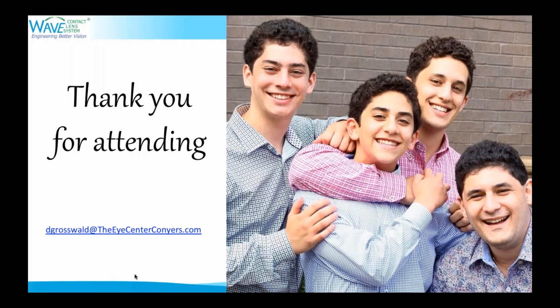And to be honest with you, I guess because I've been designing WAVE for so long, I've not paid particularly close attention to that. So I let the software design the lens and really go by what I'm seeing with the slit lamp and the values on the image that we're seeing on the OCT, and just modify from there. So I've not really looked at the bulbar slope to see if it matches up and makes sense with the edge angle and things like that, if that's what you're asking.